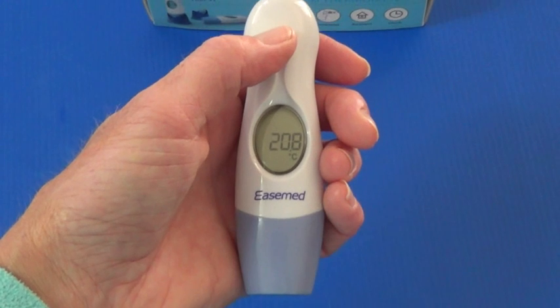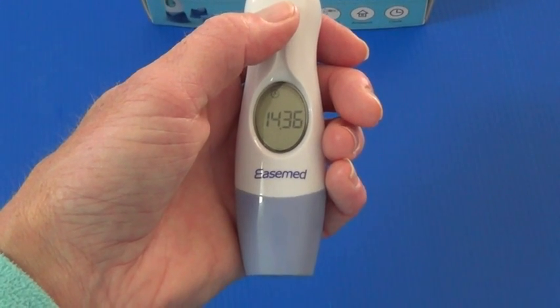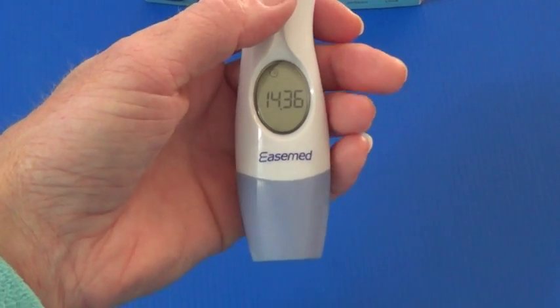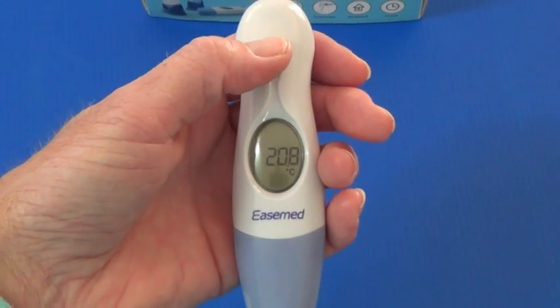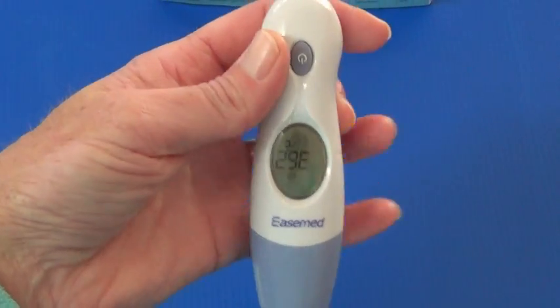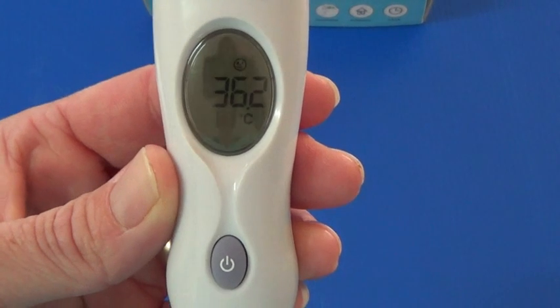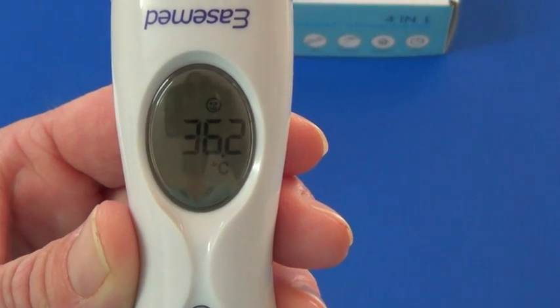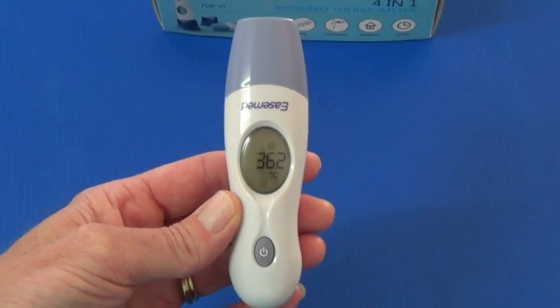Before taking the temperature, the thermometer will more likely be in the state of time environmental display. In order to deactivate that and activate the temperature mode, just press the scan button at the top. After the two beeps you will see it will automatically enter into the appropriate mode. Here you will find the icon of the happy face which means it is in the forehead temperature mode.